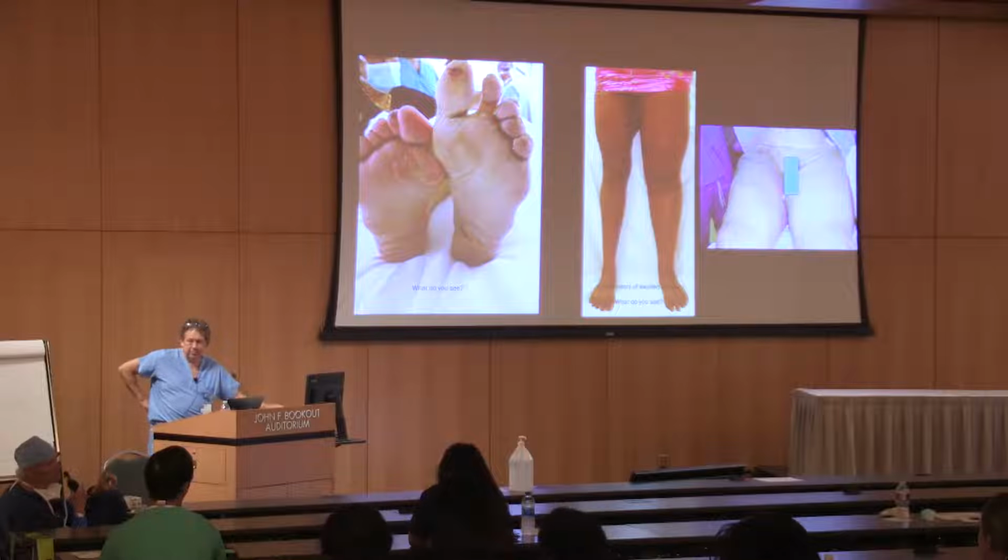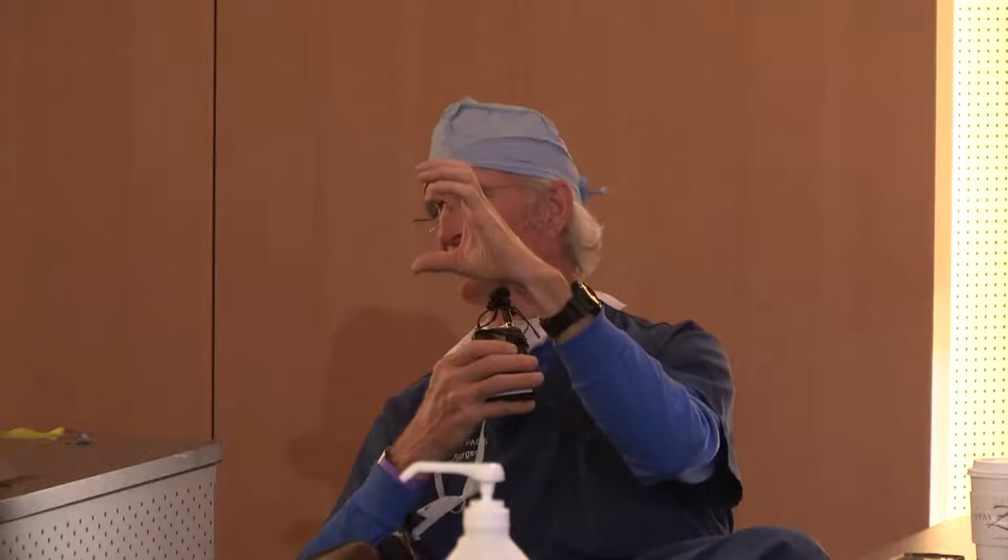Except for what? A 2. If you put saline in a number 2 Fogarty, it won't come back out. The capillary tube is too small to accommodate it. So when you're doing little tiny blood vessels, it'll even say on the Fogarty, don't put saline in this thing, because you'll get it in, the balloon will come up, and it'll just stay there.